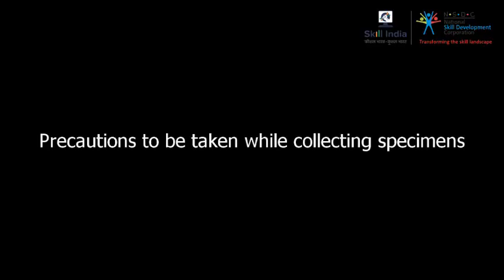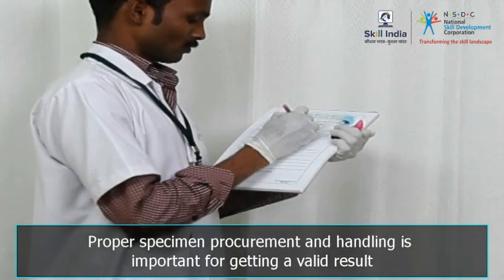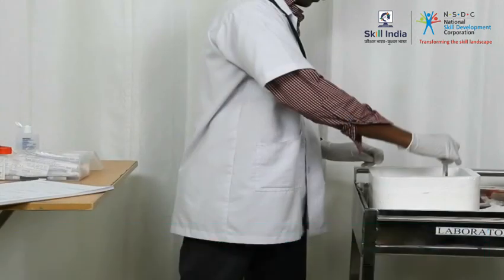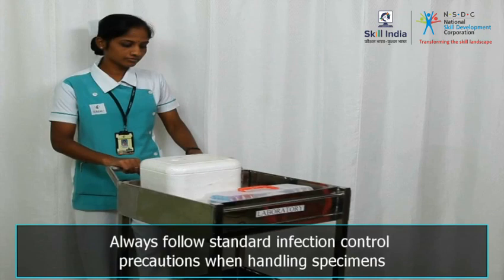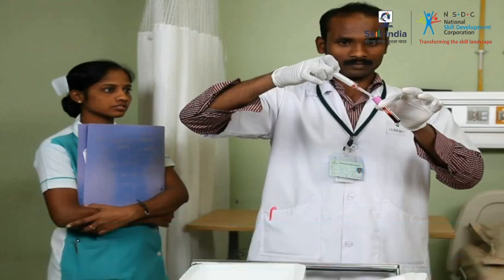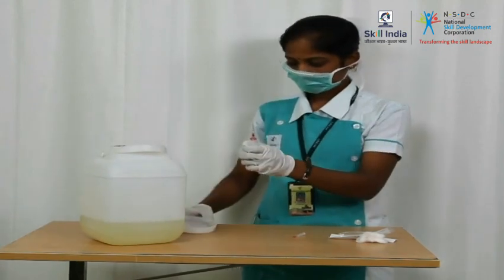Precautions to be taken while collecting specimens. Proper specimen procurement and handling is an integral part of obtaining a valid and timely laboratory test result. Accordingly, specimens must be collected in the proper tubes and containers, correctly labeled, and promptly transported to the laboratory. Always follow standard infection control precautions when handling specimens. For example, ensure appropriate protective clothing is used and waste, including sharp waste, is disposed of safely and correctly.